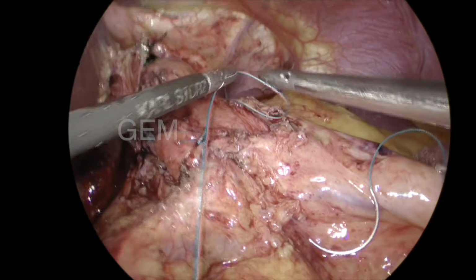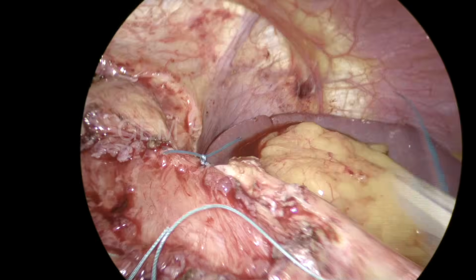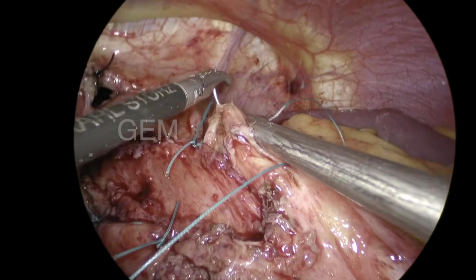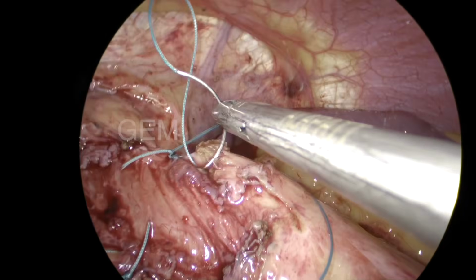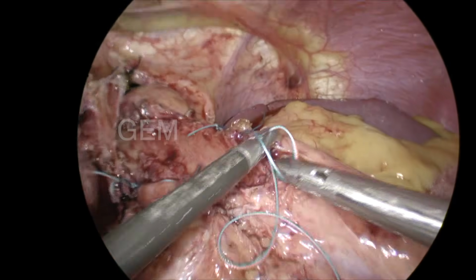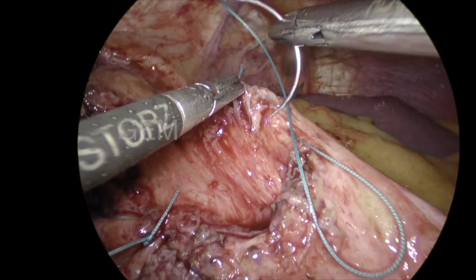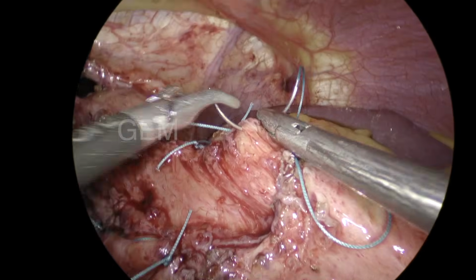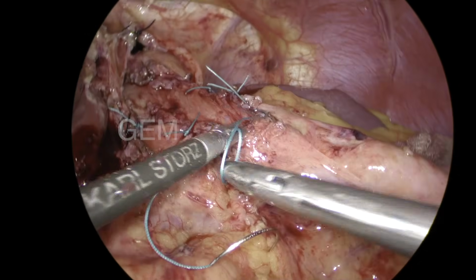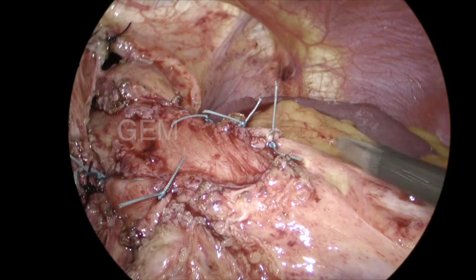This is the 2-0 polyester suture, Ethibond suture from Ethicon. A good thing about this suture is that it comes with 2 needles. If you cut the suture in the center, you will have a good length of suture, so one suture is enough. With a single needle, half of the suture will be wasted, or otherwise you have to keep a long thread inside. So that's why it is very advantageous, and the needle is also very short. So it is a good one.